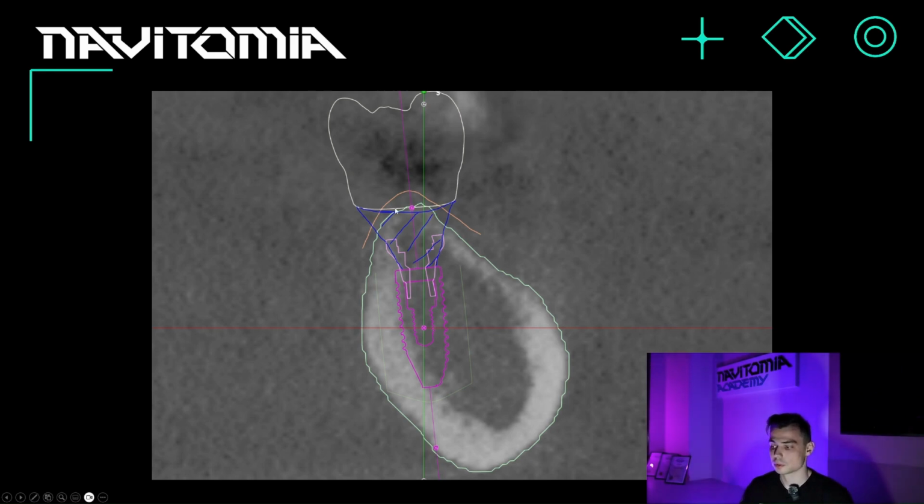And you also need to think here, in blue you can see my artwork. I wanted to show that a pretty simple problem can arise when, for example, your supplier just doesn't have such long superstructures on the market, because sometimes the implant is placed so deep that there simply aren't abutments or multi-units that are tall enough. This can also become a problem.